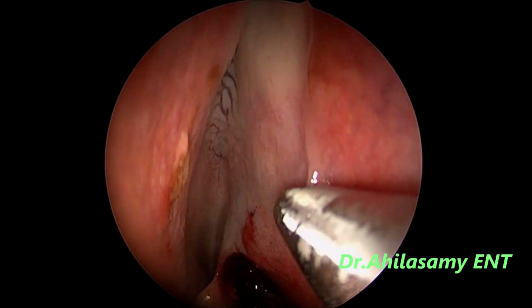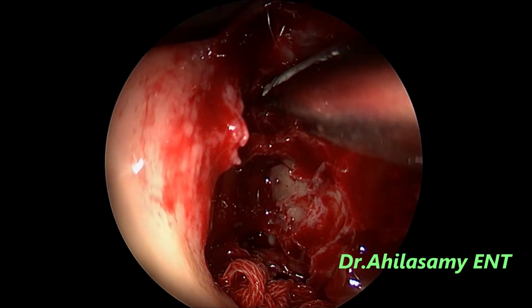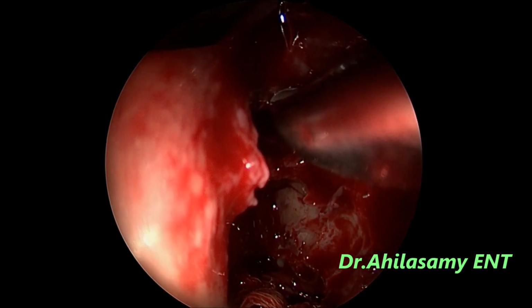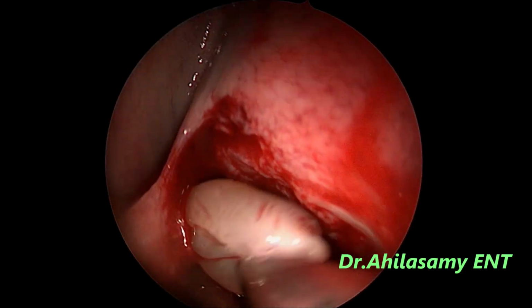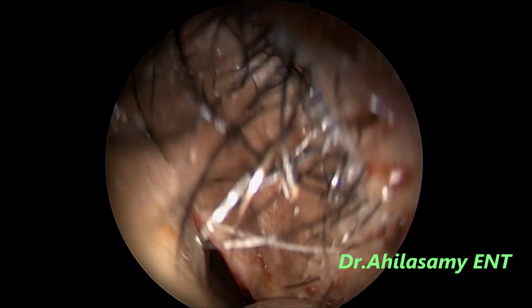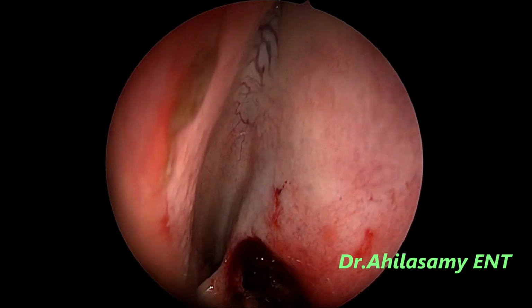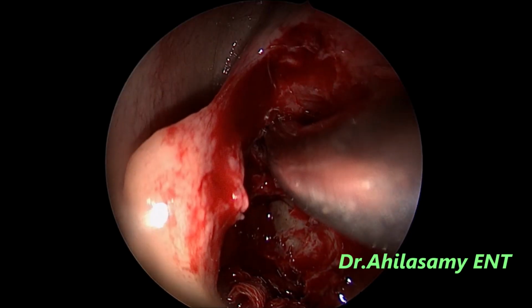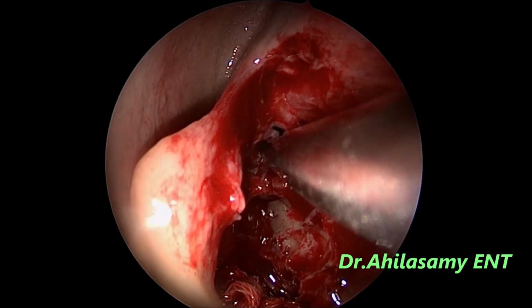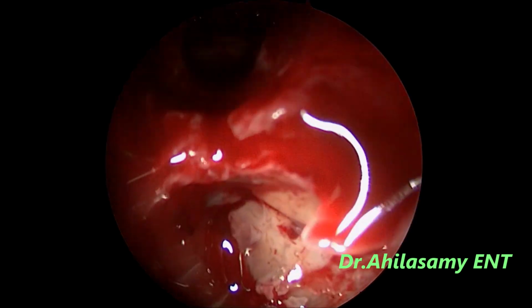So I am taking a microdebrider blade of the Xomed. You can attach it to the shaver system, and there's a big polyp from the frontal coming out. Unless you do these jobs well, the patient will not be happy or the disease will recur. Of course, the patient needs long-term medical treatment after that with nasal douches and steroid nasal sprays.